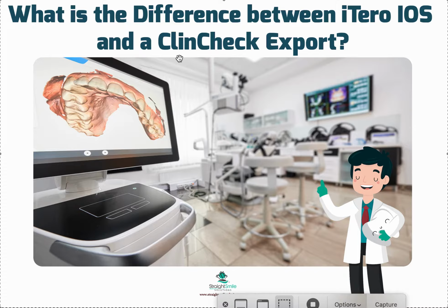A really good orthodontist or dentist might take 2, 3, 4, 5 go-rounds to get this right. Each go-round is going to take a few days. So it usually takes maybe a bare minimum of 1 week if there's a scan, up to 3 or 4 weeks to get a really good ClinCheck done. This is not something you're going to have at that first appointment. It will take a few weeks.